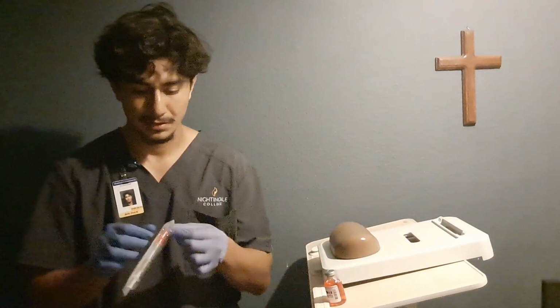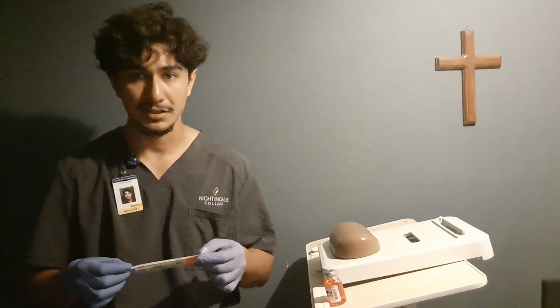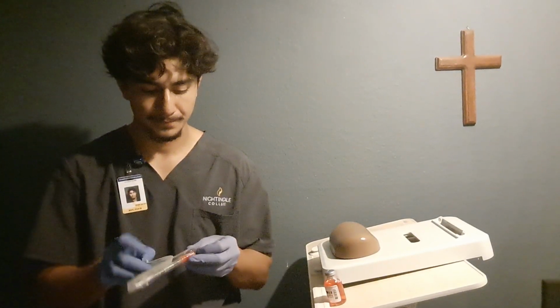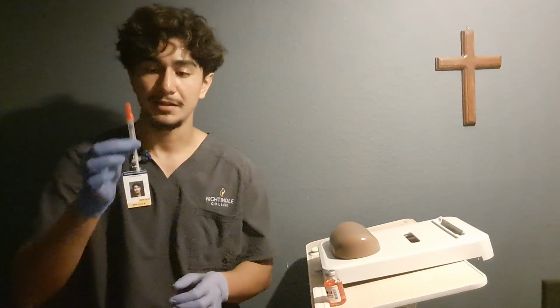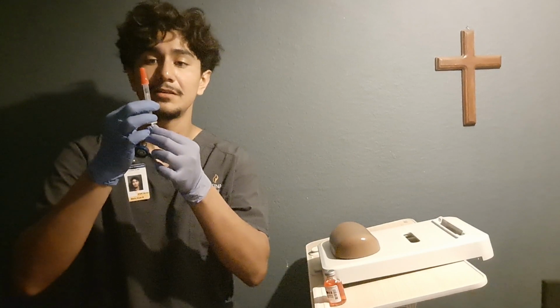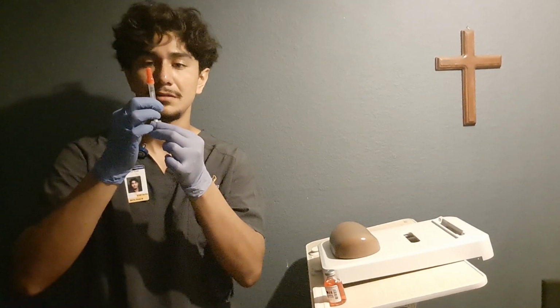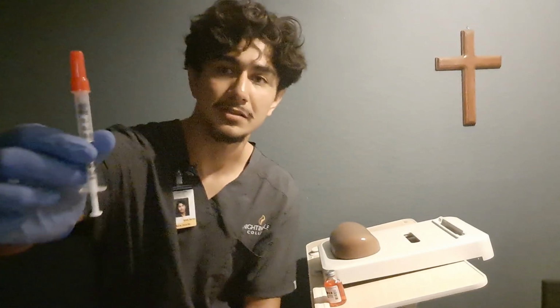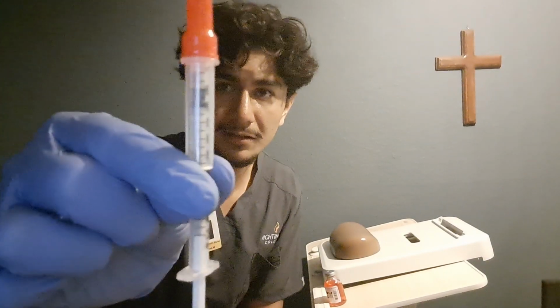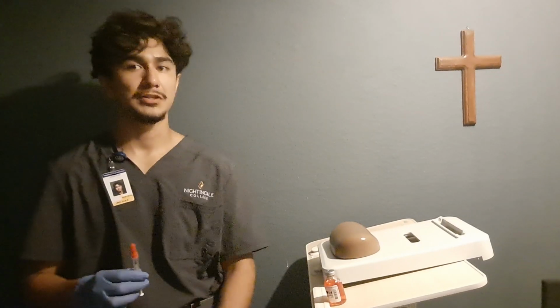So now we've got the 29 or 30 gauge half-inch needle. We're going to open the container with the needle facing up. I'm going to pull down to approximately 0.1 milliliters. So pull down to 0.1 milliliters of just air to create that negative pressure inside the vial.